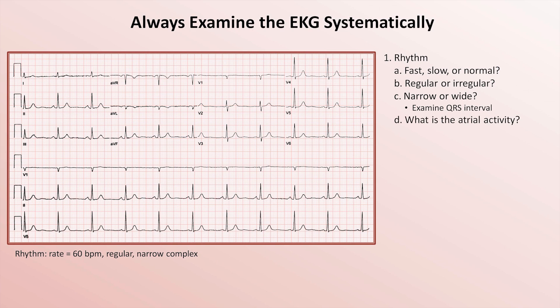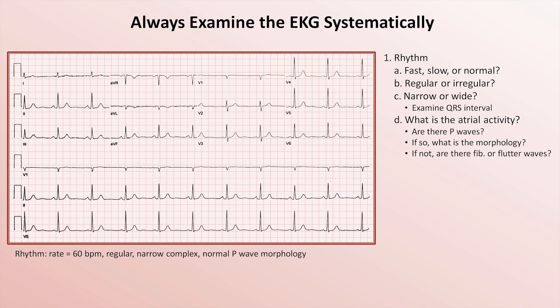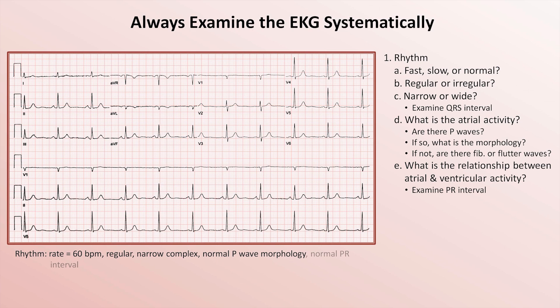Next, what is the atrial activity? More specifically, are there P-waves? If so, what is their morphology? And if not, are there fibrillation or flutter waves? In this EKG, P-waves are normal. The final rhythm question is what is the relationship between the atrial and ventricular activity, which requires examination of the PR interval — normal here — and recognition that there is a one-to-one relationship between P-waves and QRS complexes, with each P coming immediately prior to the corresponding QRS. From those five steps, we should know the rhythm, which is normal sinus.